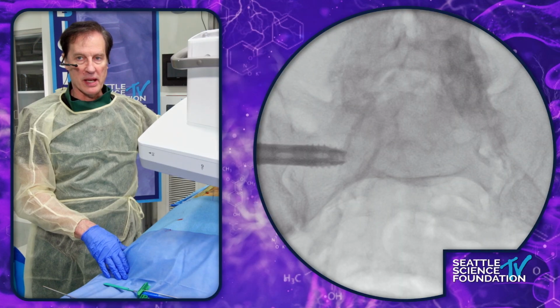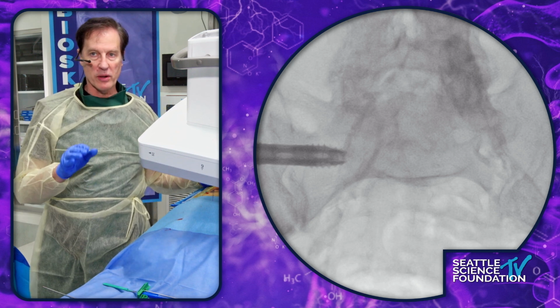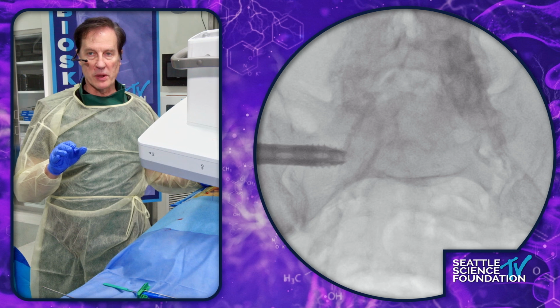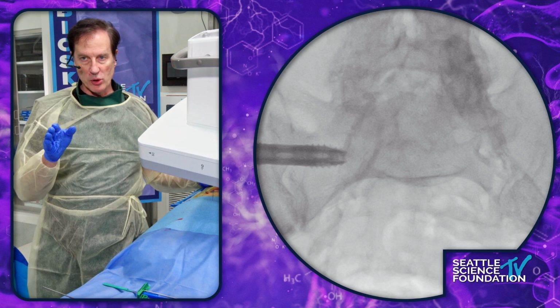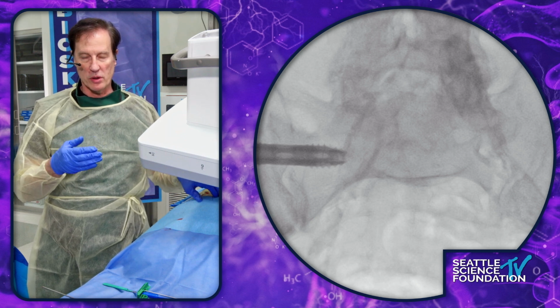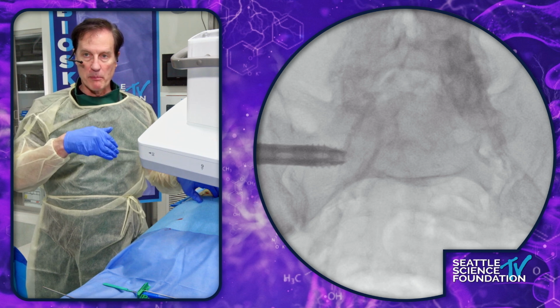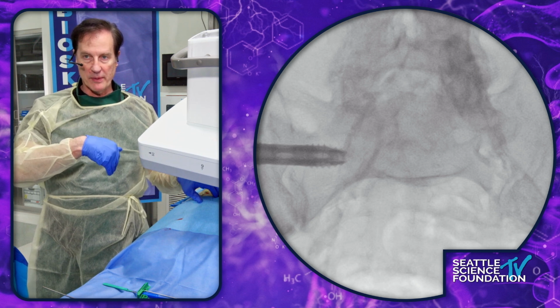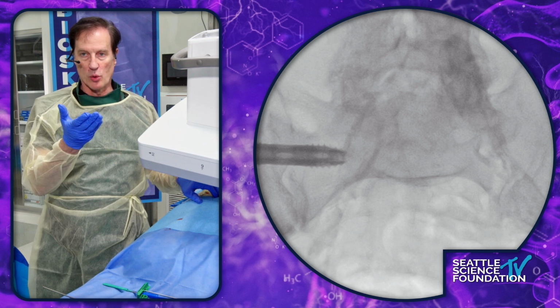As you sharpen that joint up, the iFuse-X is placed right into the joint on the pelvic inlet view. You see the more medial part, that's the part of the joint that's more posterior toward us. The more ventral part starts to become more oblique as it goes ventrally, and this one is more anteroposterior as it is the dorsal part.